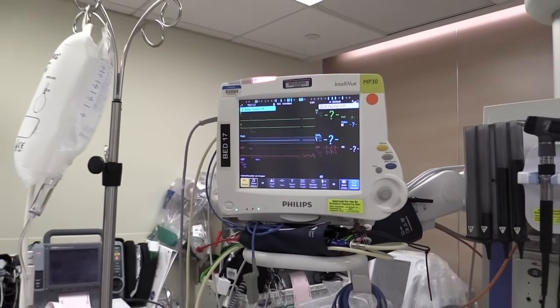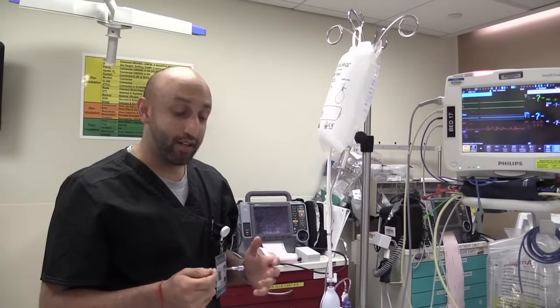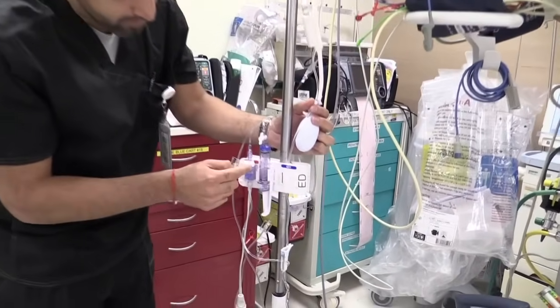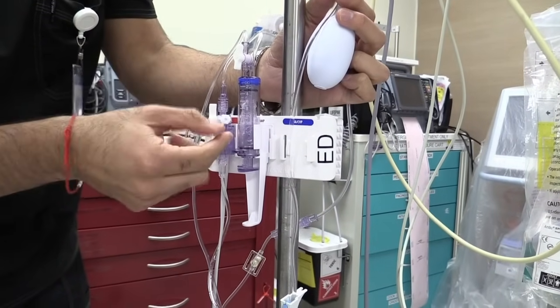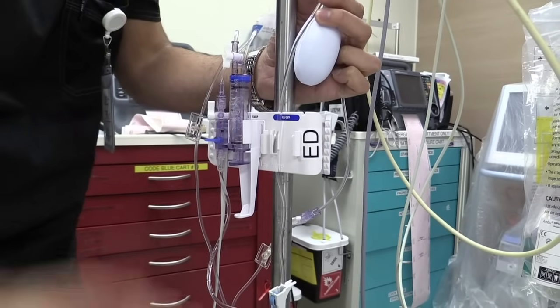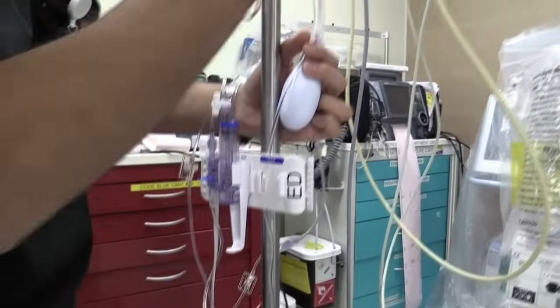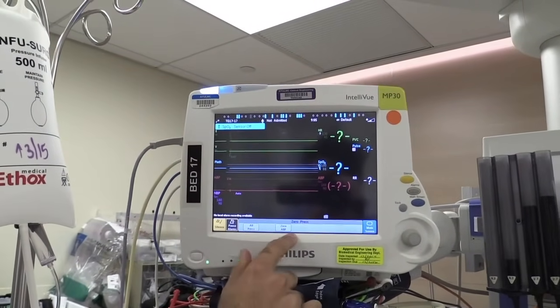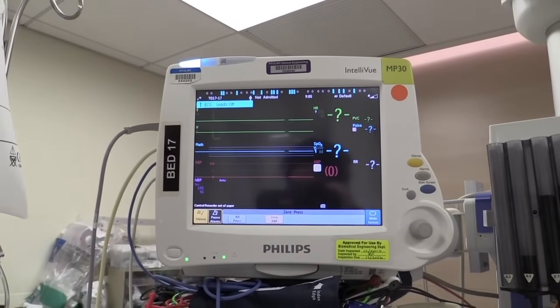The last part is leveling the arterial line — you want to zero it and make sure it's zeroed to the atmospheric pressure. The way you're going to do that is expose this port to the atmosphere. First, take the stopcock and turn it upwards so it's off to the patient. Then unscrew this cap — now you're essentially exposed to the atmosphere. You have to tell the computer that this is what zero should be. Press the zero button on the monitor, two more options pop up, and you press zero ABP — zero arterial blood pressure. Press that again and essentially that is zeroing it for you. We're right at zero.